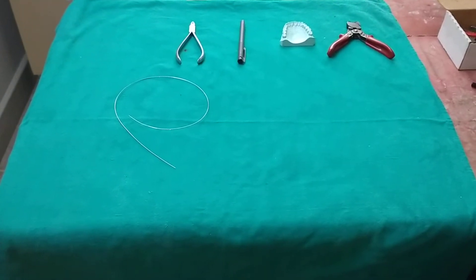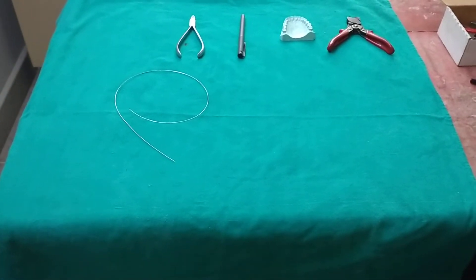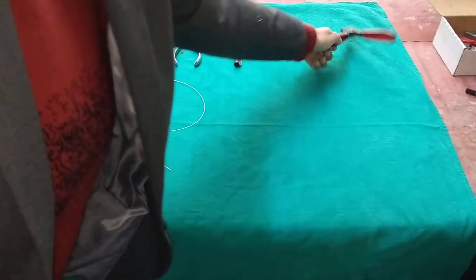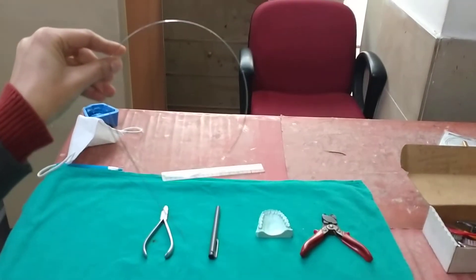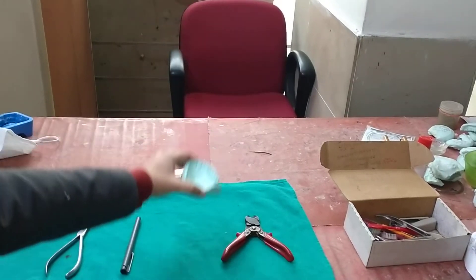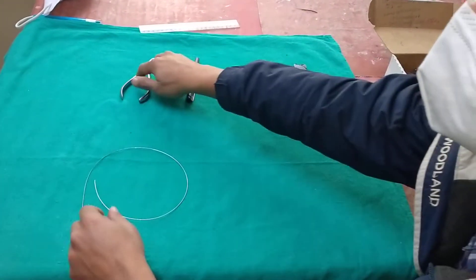Today we are going to make a C-clasp, or a circumferential clasp, which is also known as a three-quarter clasp. It is made up of 0.7mm stainless steel wire, or 21-gauge wire. The armamentarium we need is a hard wire cutter, 21-gauge wire, Adams plier, a marker, and a cast. Now we will show you how to make a C-clasp.